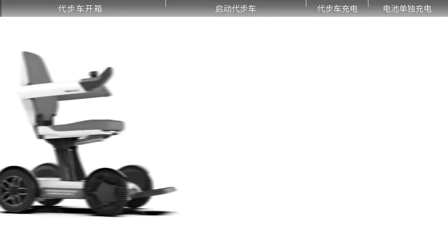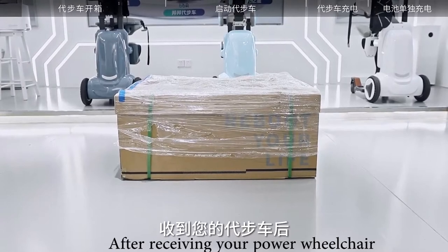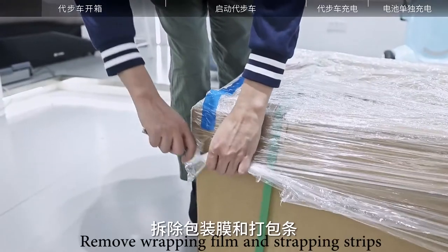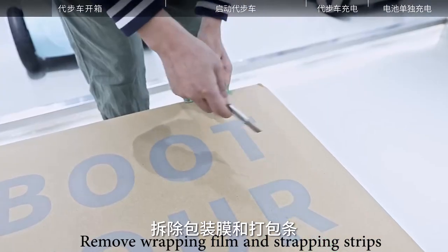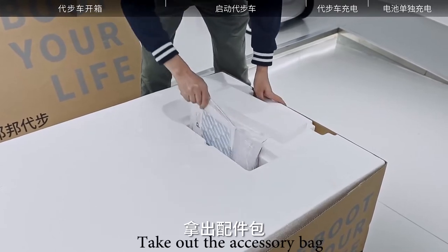Unpacking the Scooter Model Robooter X. After receiving your power wheelchair, place it in an open space. Remove wrapping film and strapping strips. Open the top cover of the box. Take out the accessory bag.